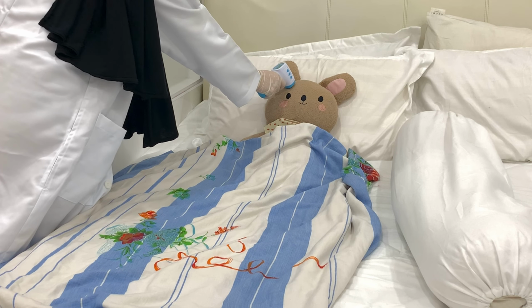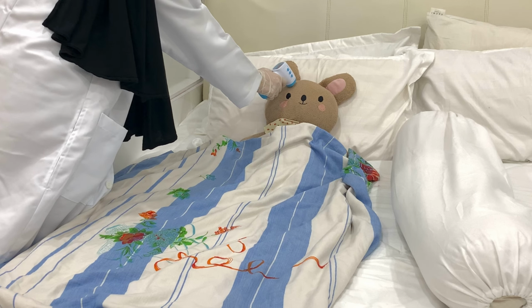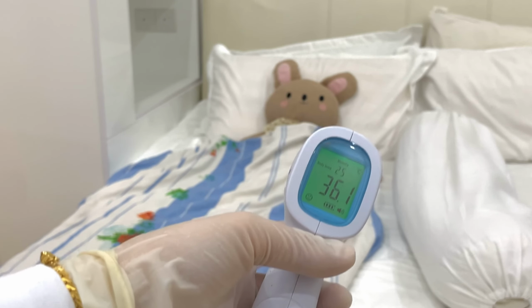I also need to take the patient's temperature to confirm the patient doesn't have a fever, and in case the patient's body temperature is higher than normal, I'm also going to report this. From what I can see, the temperature of the patient is perfectly normal.